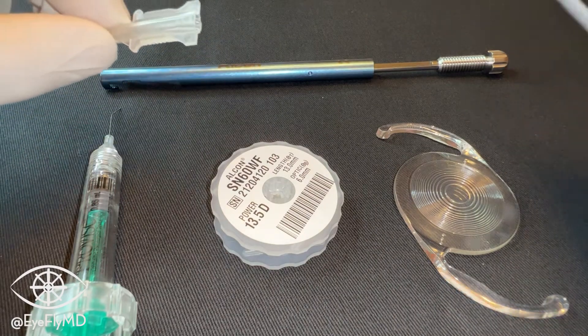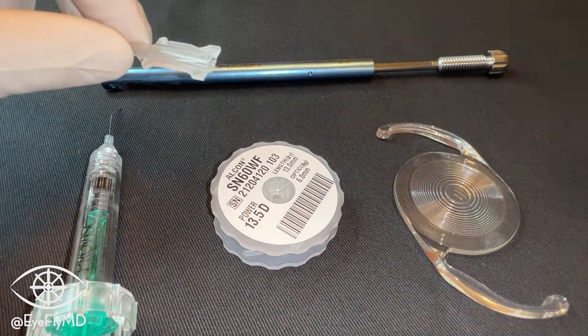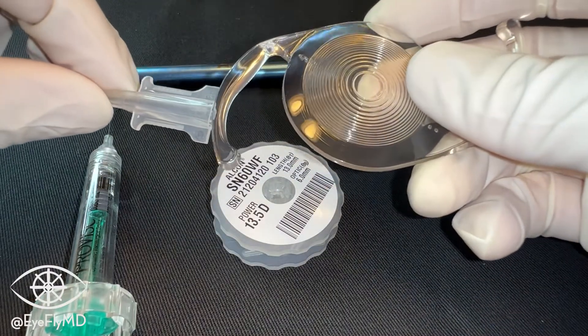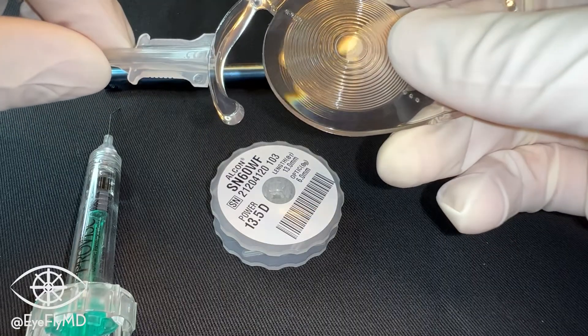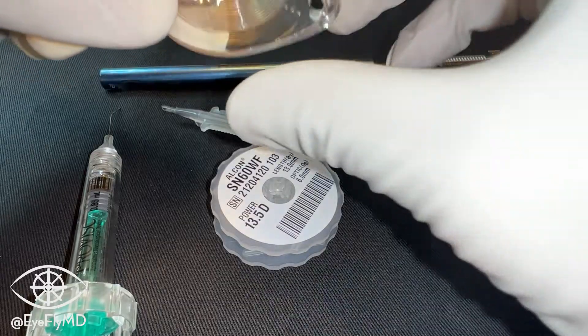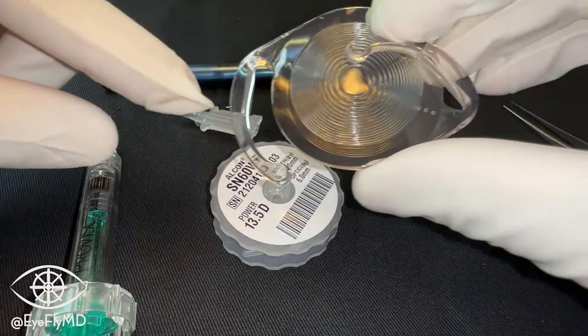To load a single-piece IOL, we'll usually be using a C cartridge or a D cartridge — C for acrylic. The entire goal is to use the top of the cartridge first to push the leading haptic of the IOL over the actual optic, just like that. Then with the forceps, tucking the trailing haptic over the optic as well. So the whole IOL will be moving through the cartridge like a taco.